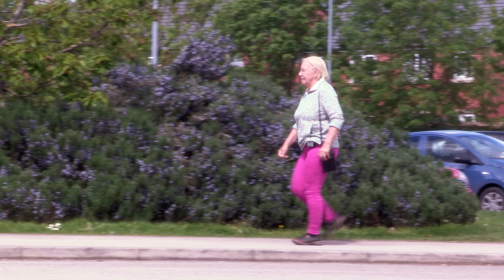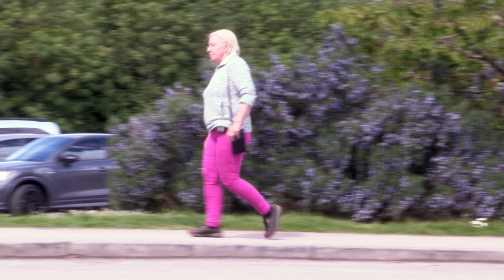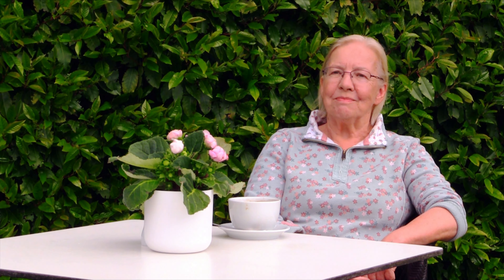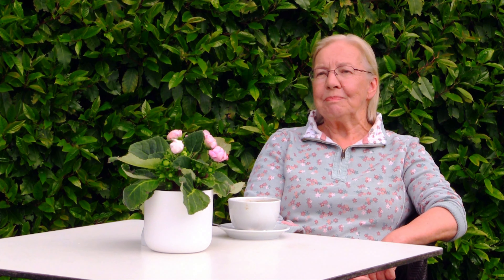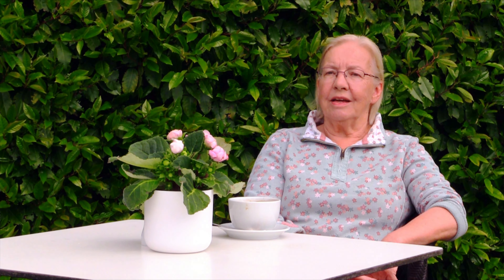I'm Pam Banks, I'm 72 years of age and I've quite recently been diagnosed with MS. I had various symptoms that came and went over the years but people started to comment that I was dragging my left leg, I was limping and dragging my foot. Eventually I went to the doctor and he sent me to a physiotherapist who gave me exercises to try and improve the function of my left leg and strengthen the muscles, but he said it might be useful to go back to the doctor to see if I could be recommended for an FES gadget to attach to my left leg.